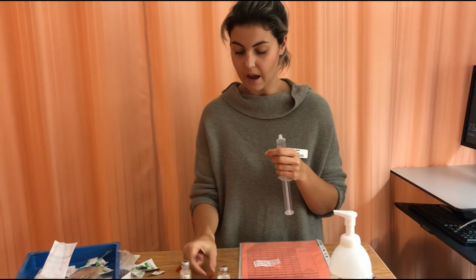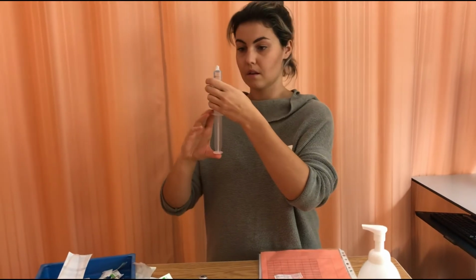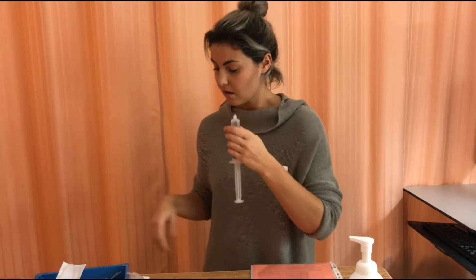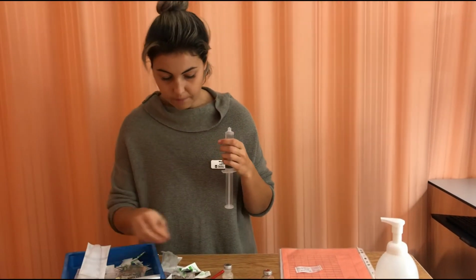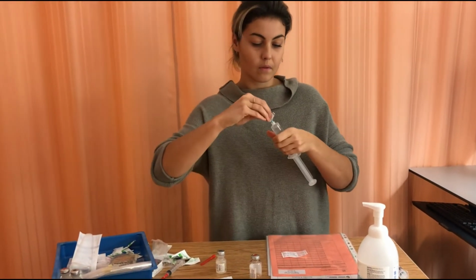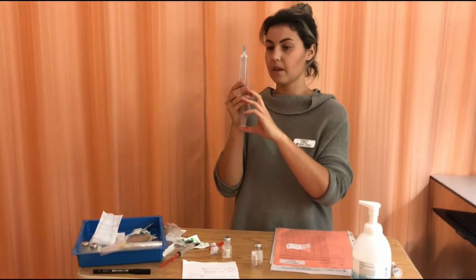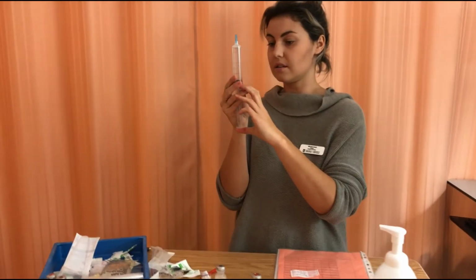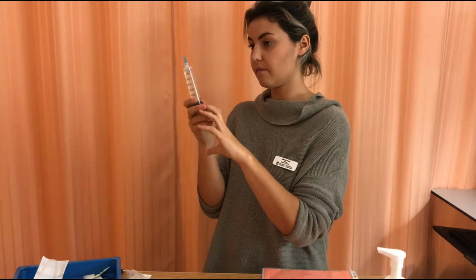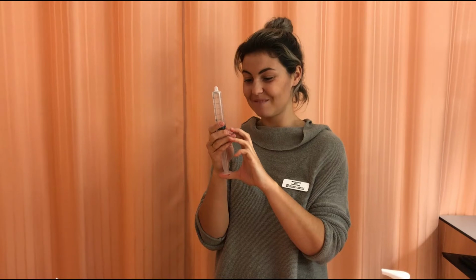And this would just be recapped and placed in the sharps. Place my blue cap on. Make sure there's no bubbles, and ensure that it is a volume of 30 mLs.